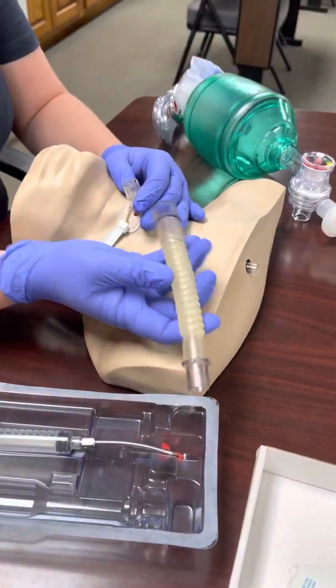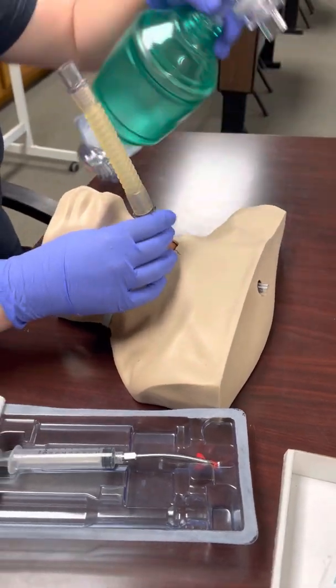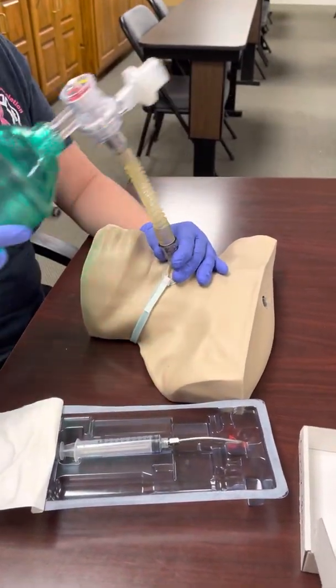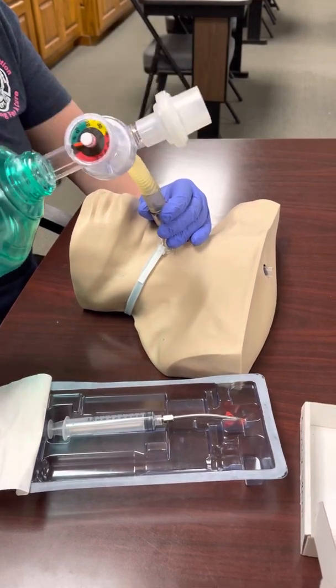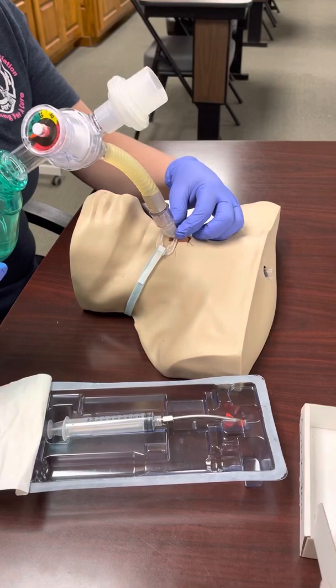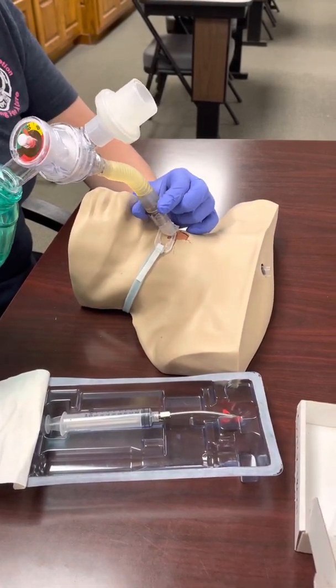Now we can go ahead and connect the BVM. We have this nice adapter — because this is a short tube, the adapter reduces resistance and gives a little more movement with the BVM, so you're at less risk for pulling out the tube. From here you can just bag your patient until you get to the hospital. Make sure you're putting the securement strap in place as well.